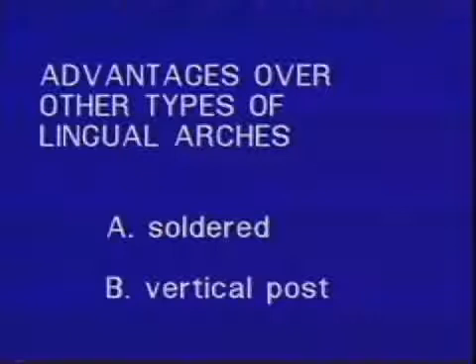The soldered lingual arch and the vertical post lingual arch are currently being used, but they have their limitations. The soldered lingual arch cannot be adjusted unless the bands are removed and re-cemented. It lacks a certain precision and adaptability.